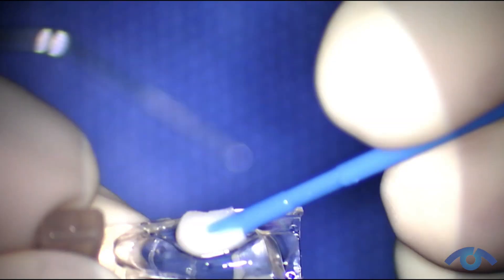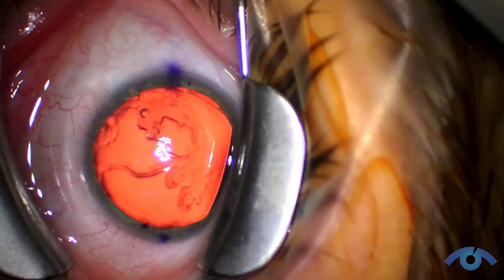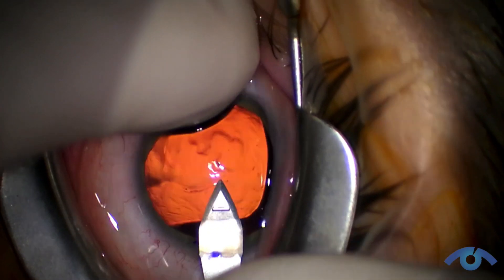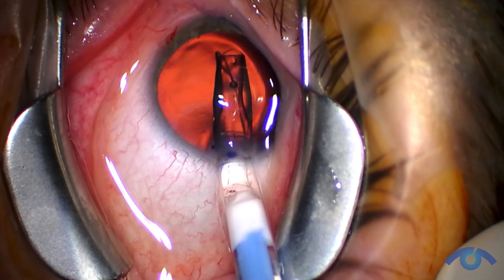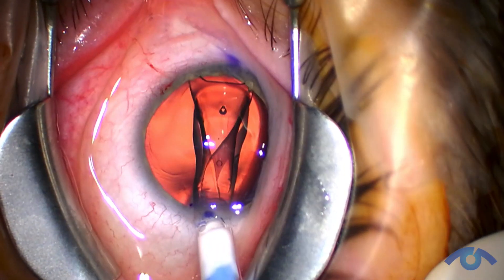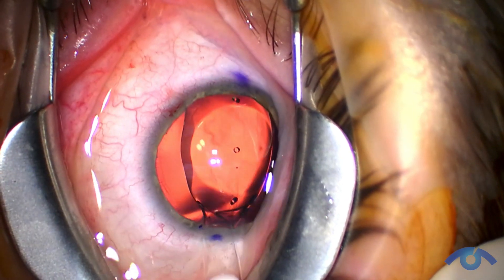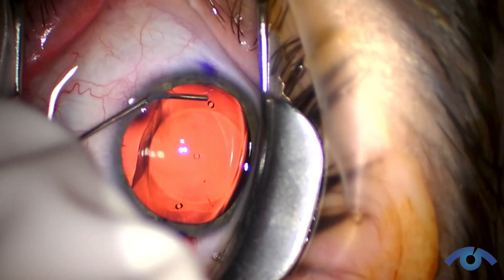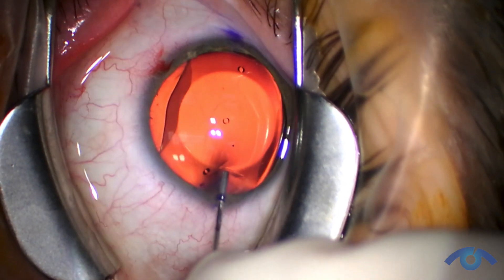During ICL surgery, I use a lid speculum to hold open your eye so you don't have to worry about that. I do make a small incision, about one millimeter, and then a little larger incision — about 2.6 millimeters — and the lens is injected from that larger incision. You'll see it open and fold out; it's a fairly large, kind of rectangular lens. I tuck all four quadrants of the lens implant behind your iris, and it's placed right in front of your natural lens.